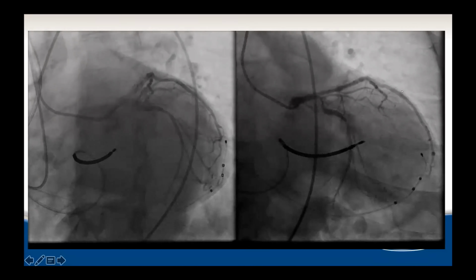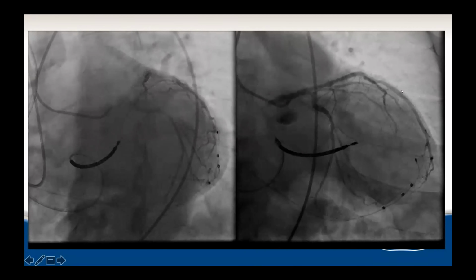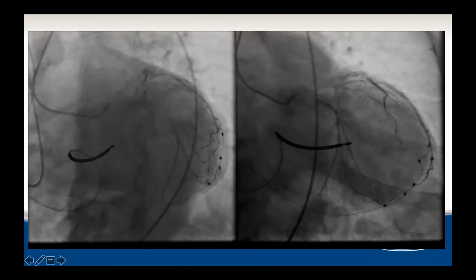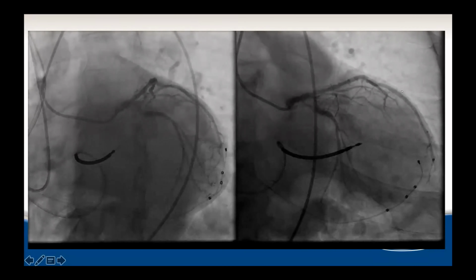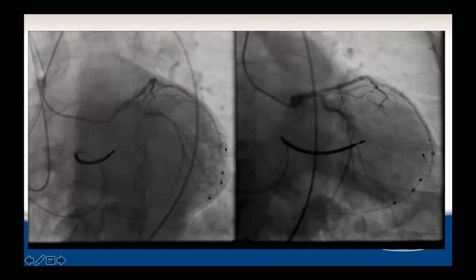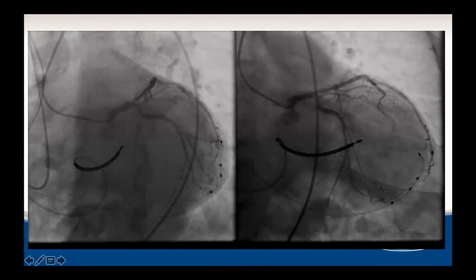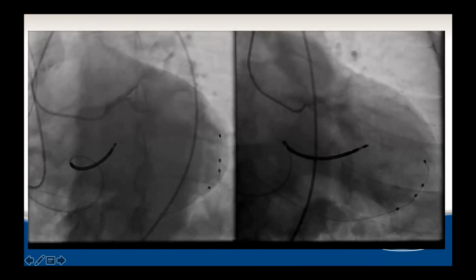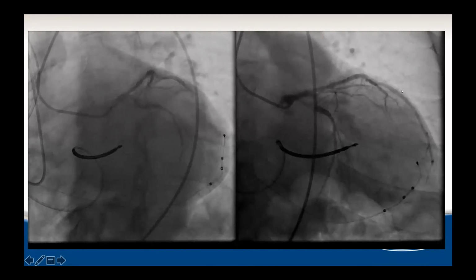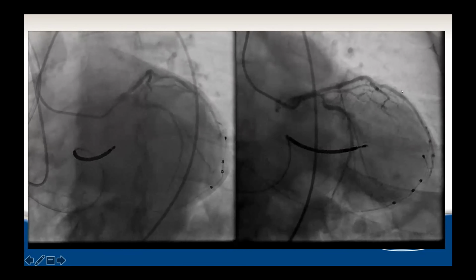Yes, I think for starters, as an early operator, when I'm going through these cases in this exact type of scenario, I always had like six ways that I'm going to treat all the branches and bifurcation strategies. And in general, the senior guys in our lab are talking me down off the ledge a little bit, keeping it simpler. Thinking back to our earlier conversation, it's always this balance of the efficiency of the case, making sure you get what you need today, so that you don't spend so long on a smaller branch, trying to perfect that to the point where the patient's coming off the table and you're still trying to treat the bulk of their disease.